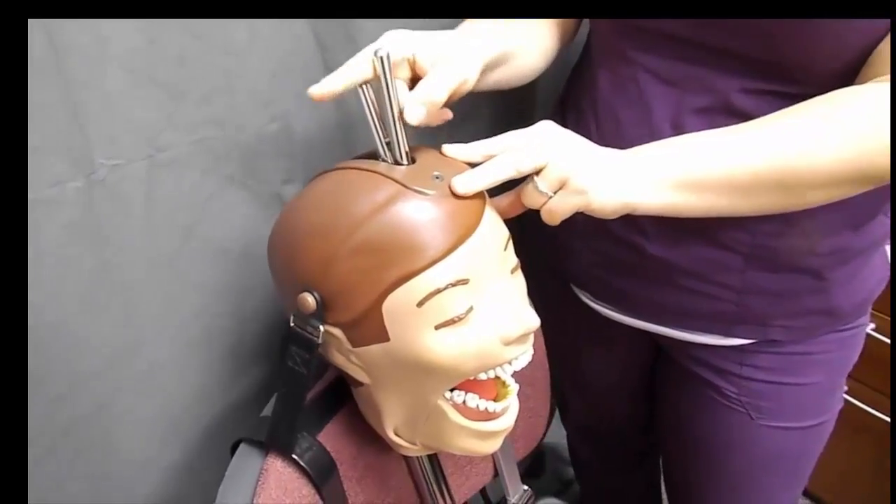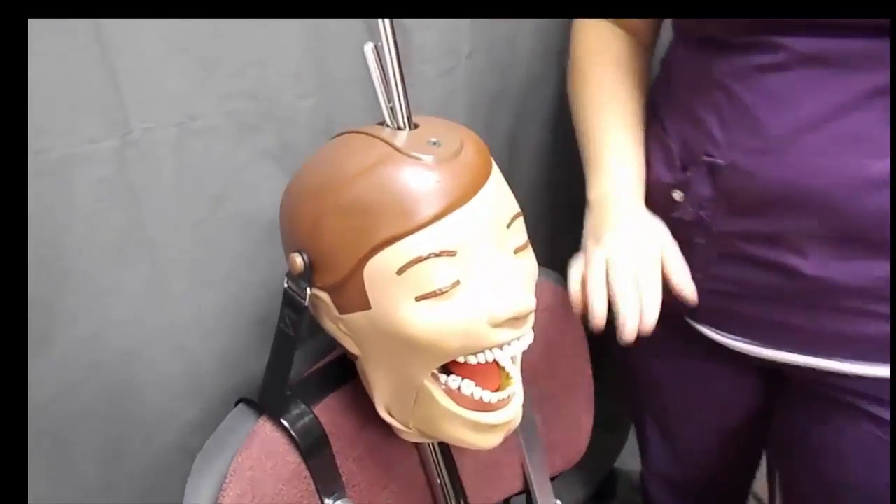As always with Dexter, to get him to open or close, simply bring the handle forward and back.